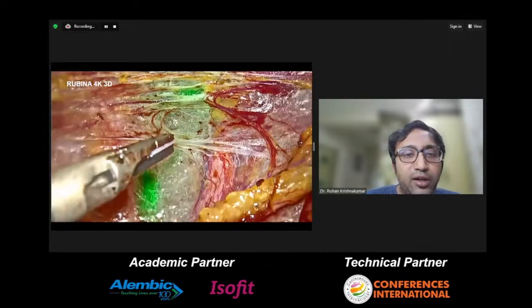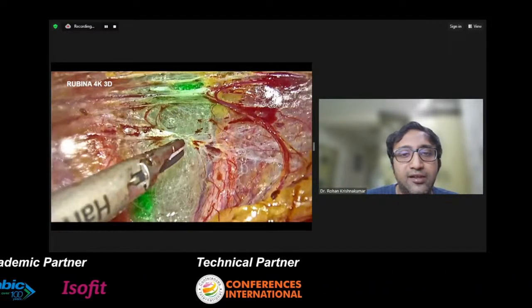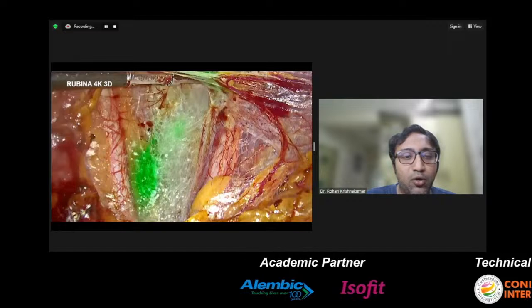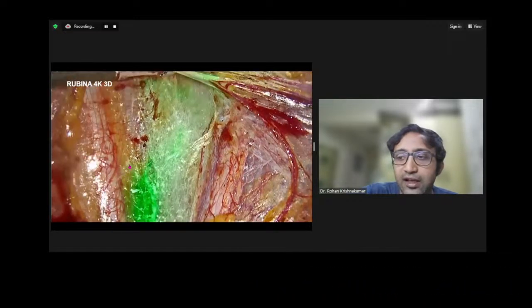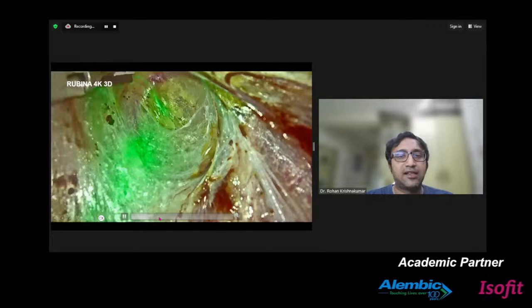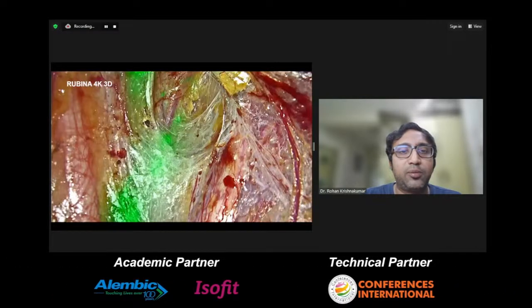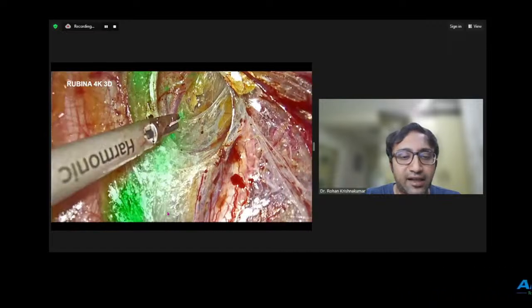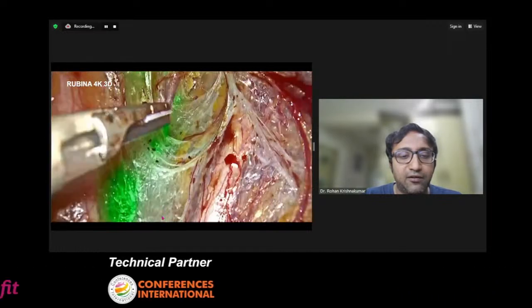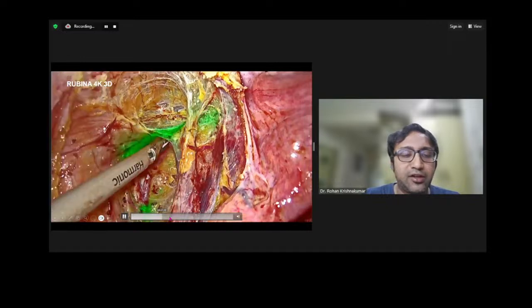So going further ahead, this is something new. This is the Rubina 4K 3D, which has so many modes that it is difficult to express. Here you can see the retroperitoneum is already open, and we can very clearly see the green stains. That is the ICG, and this has overlay, so you don't have to switch. That's the uterine artery there, opening the pararectal and paravesical spaces. I'll just fast forward a bit so that I don't repeat things. So this is just the retroperitoneal anatomy.